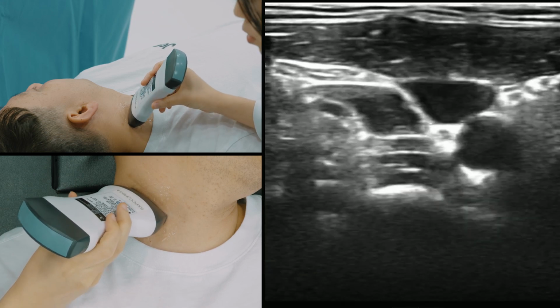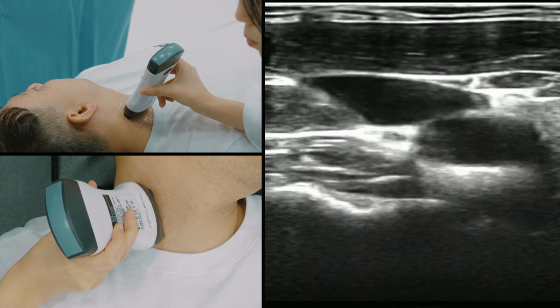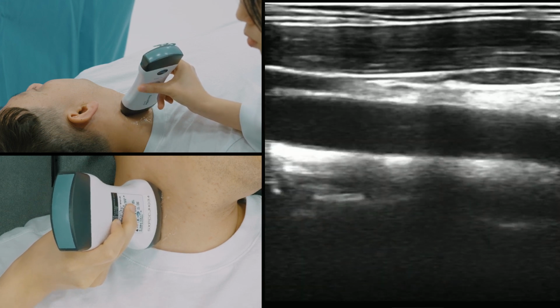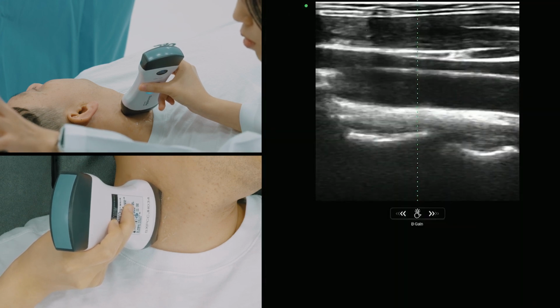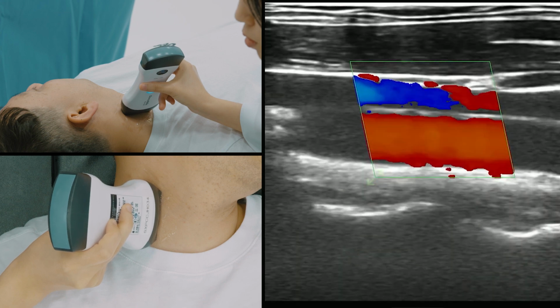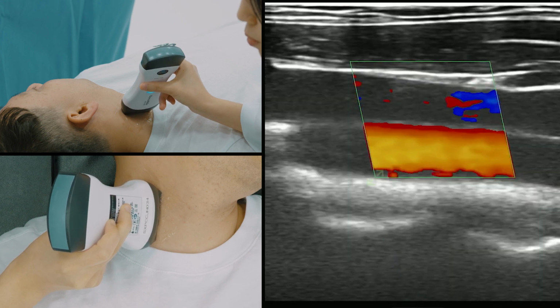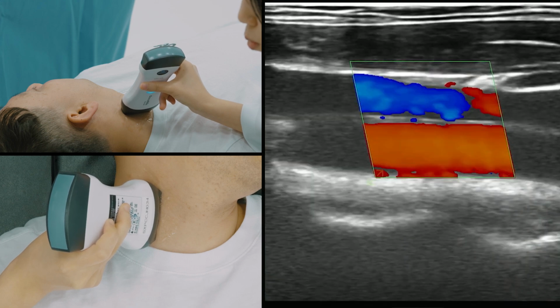To precisely differentiate between venous and arterial vessels, employ color Doppler imaging and Doppler flow measurements, yielding detailed flow profiles. The SonoMe H5C10L features both B mode and color Doppler mode, providing comprehensive imaging and flow measurements suitable for thorough examination during this procedure.